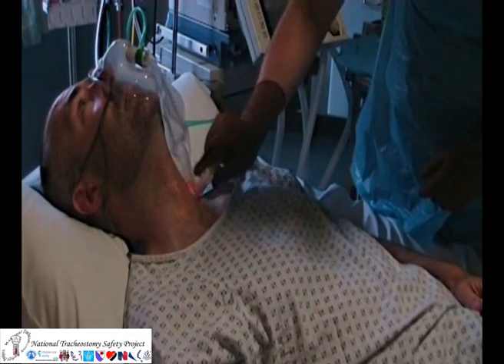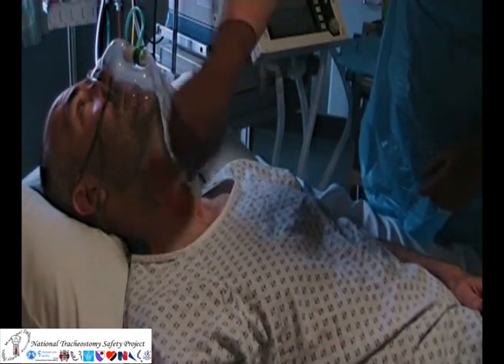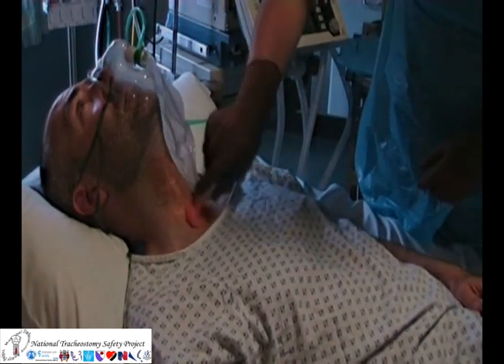If time allows, the anterior neck should be cleaned with an appropriate skin solution and the area prepped as a sterile field.